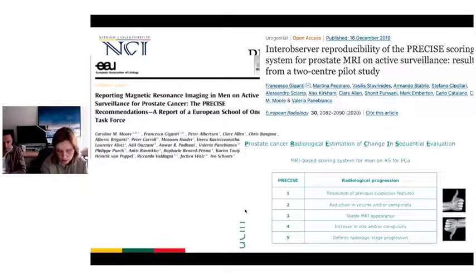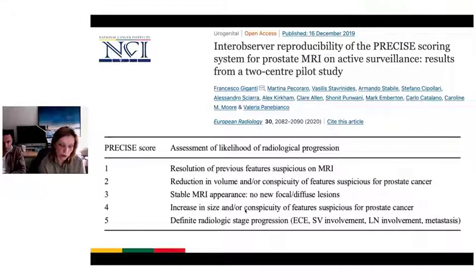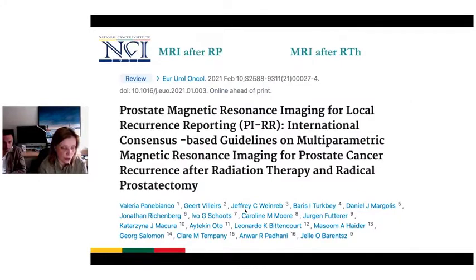So I think that later it will go into PI-RADS, maybe 3 or 2.2, who knows, into later guidelines, but it's just a recommendation to look for this paper and to see how it is scored.